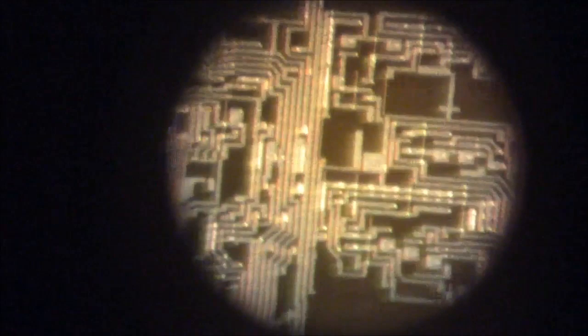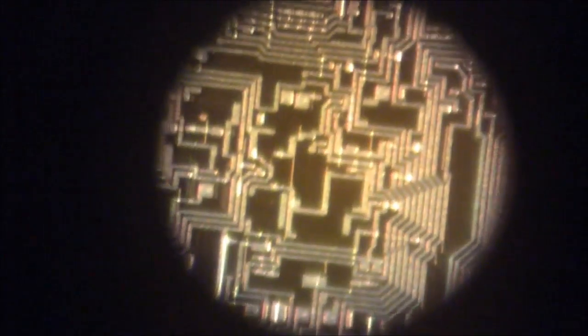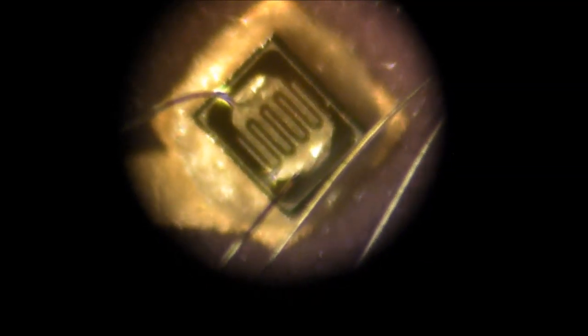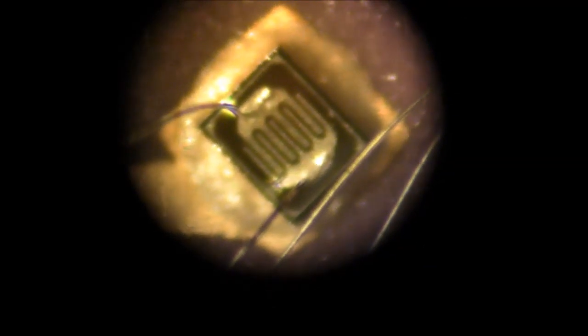Well, there's some numbers, 80-7. I wonder if that means that it was made in 1980, perhaps. The pacemaker was dated from 1984. Oh yeah, let's look at this little thing down here. Well, that's definitely some kind of transistor. It looks like a BJT.